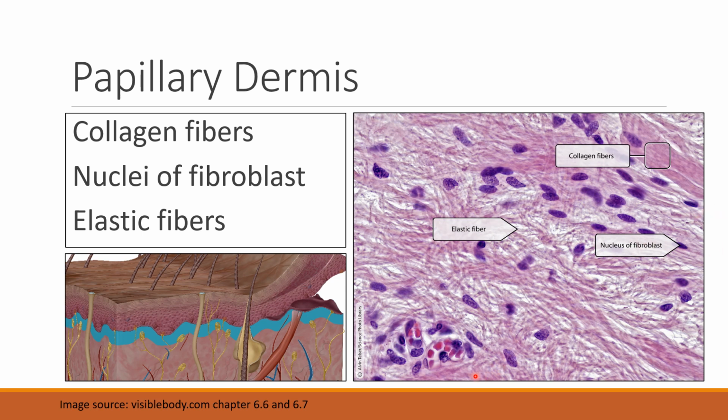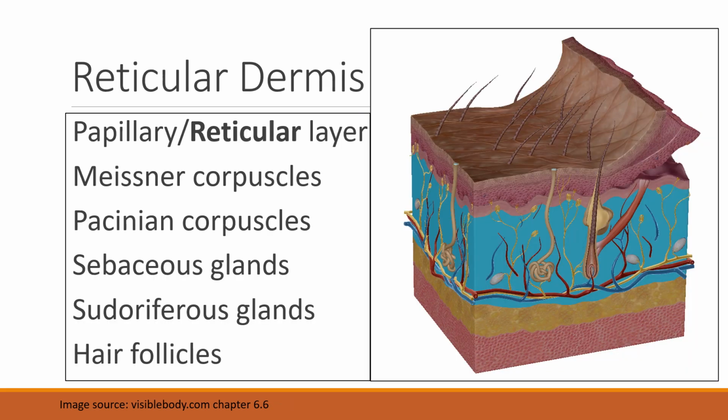So looking at this papillary dermis, we can see that there are some collagen fibers, some elastic fibers, and then these nuclei here, these are fibroblasts. Fibroblasts are responsible for generating this extracellular matrix here in the dermis. So that's the papillary layer. Here is the reticular layer down below that, this thicker bottom zone.